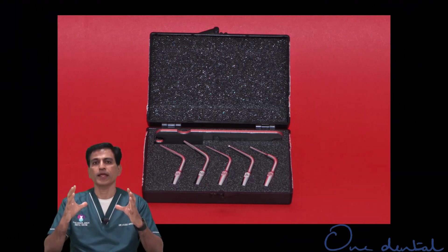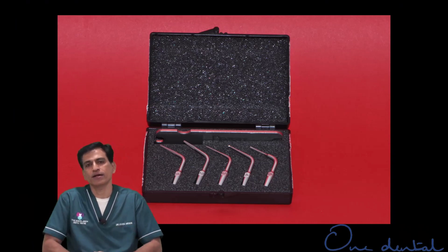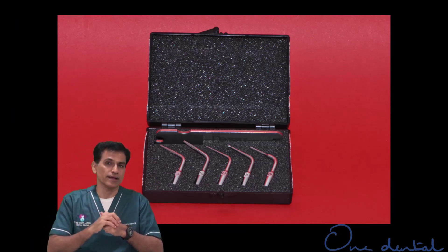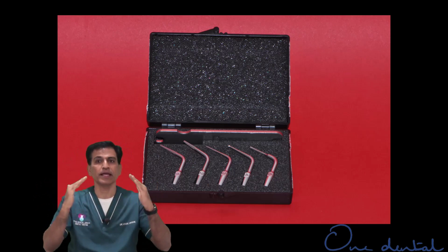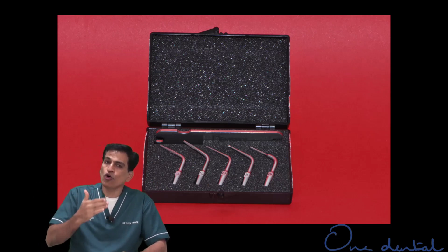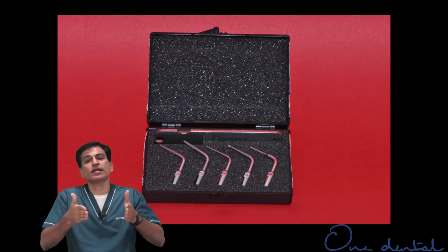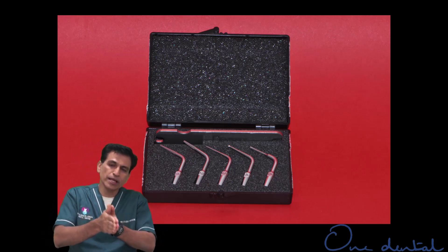Short, stout tips are used up to the entry point and cannot go into the root canal space because they're too wide — bur-sized or bigger. They may be rounded, ball-ended, or inverted cone in shape. When you go into the root canal, you need to change the tip to a more pointed or tapered tip with different diameters that can go deeper into the canal.